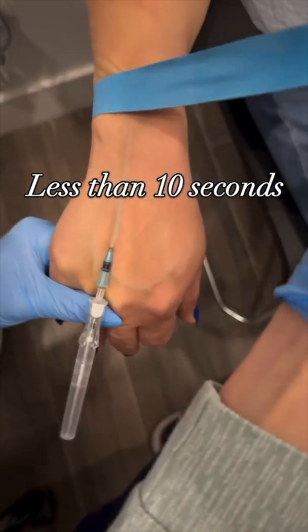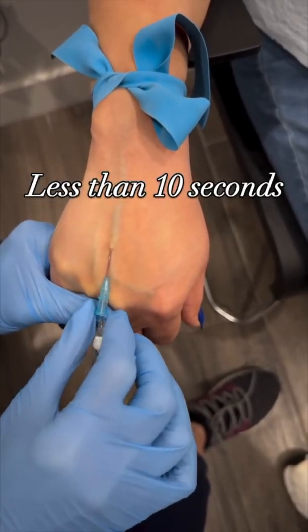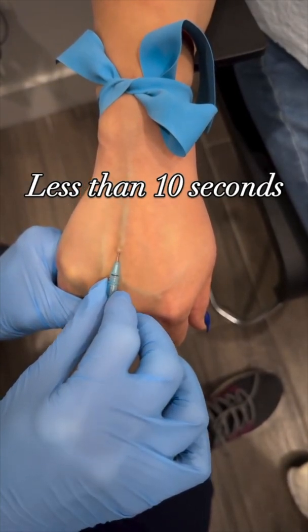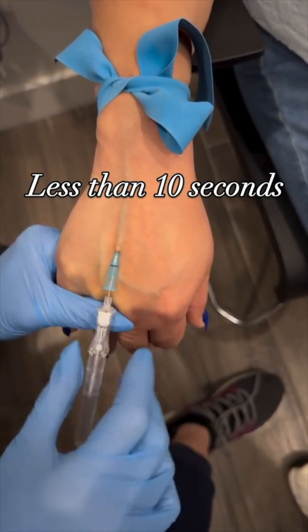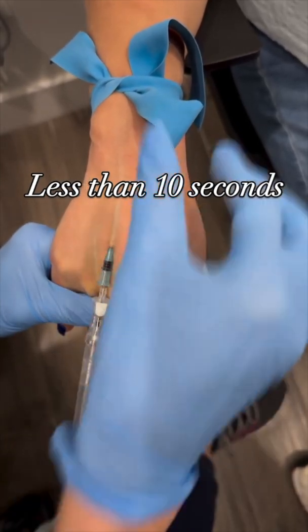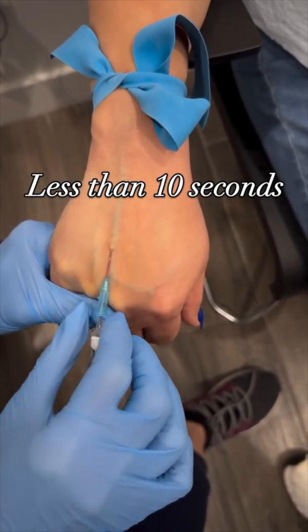Let's talk about this. First of all, that's not the only thing — less than 10 seconds. This looks like a BD catheter. I know Braun catheters want you to avoid advancing both the catheter and the needle when the needle's already partially withdrawn. There was a case where using this technique caused a catheter fragmentation.